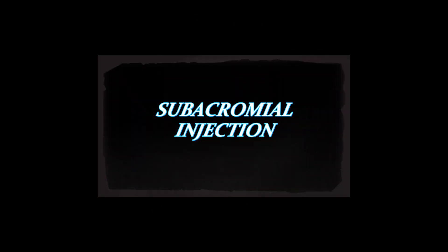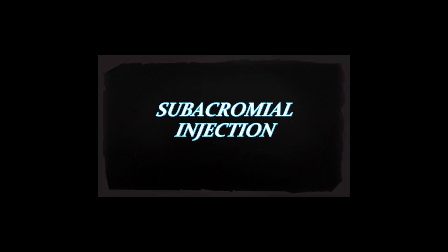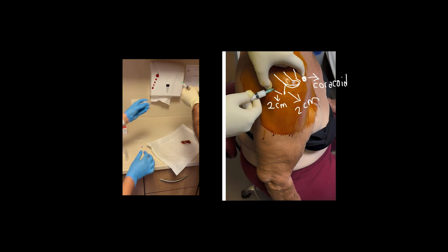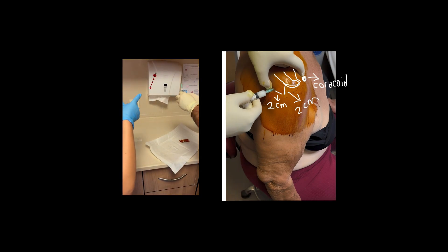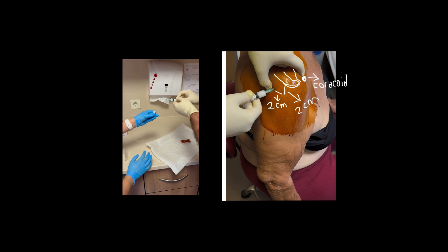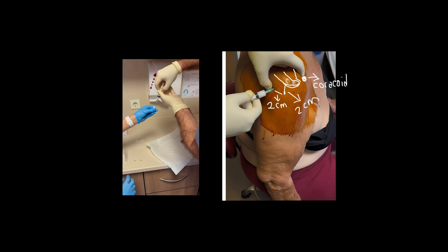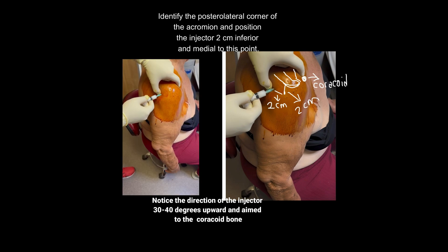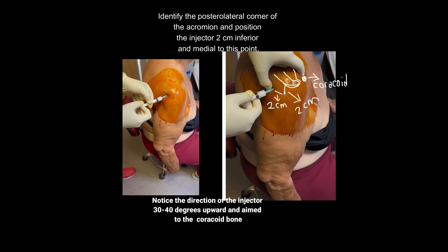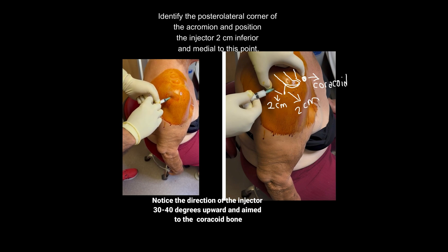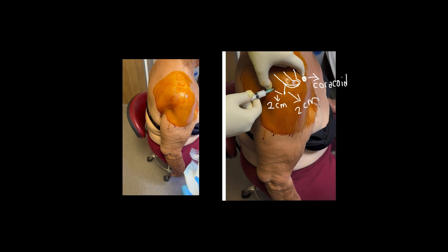Subacromial Injection. Identify the posterolateral corner of the acromion and position the injector 2 centimeters inferior and medial to this point. Notice the direction of the injector: 30-40 degrees upward, and aim to the coracoid bone.